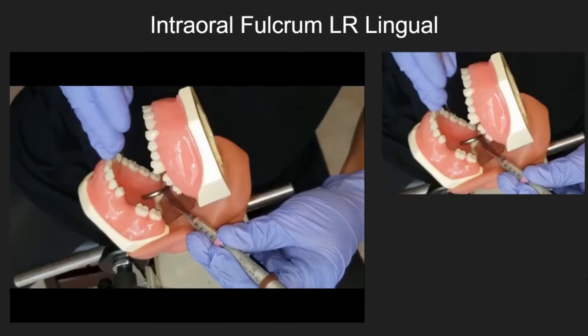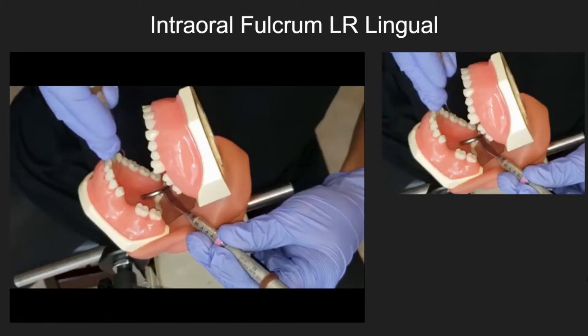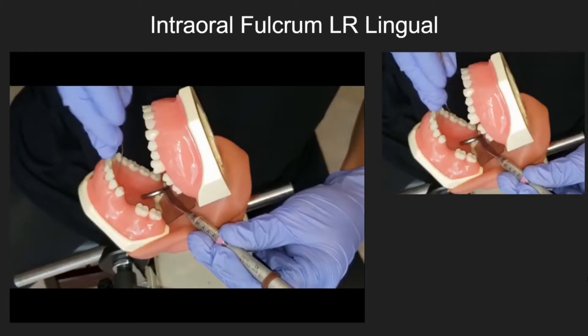Intraoral fulcrum — lower right lingual.